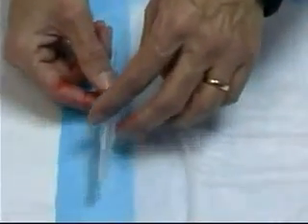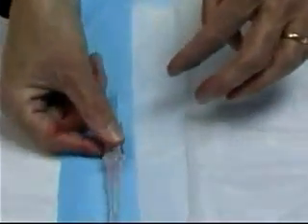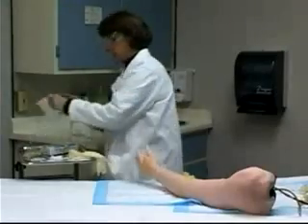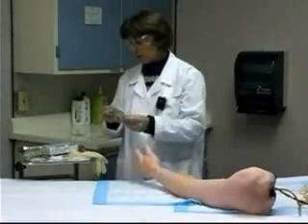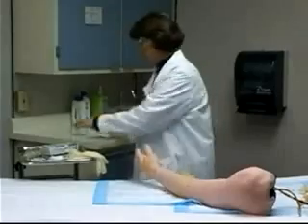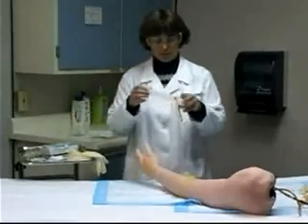I just put it back into the protective covering to maintain the sterility until I'm ready to insert the needle into the vein. And I can open up my occlusive dressing and have that ready to go. I can also prepare my tape.